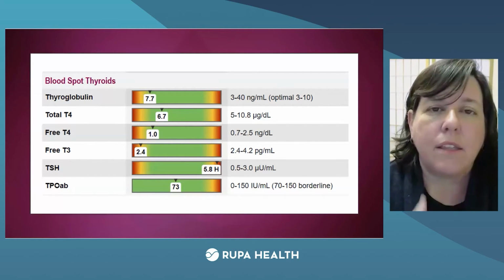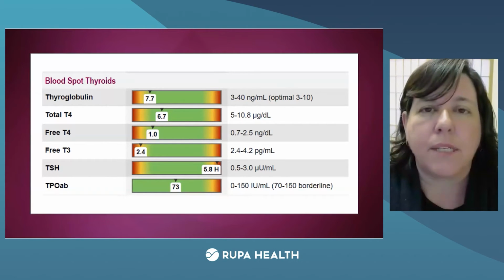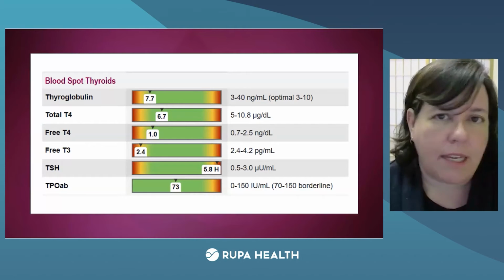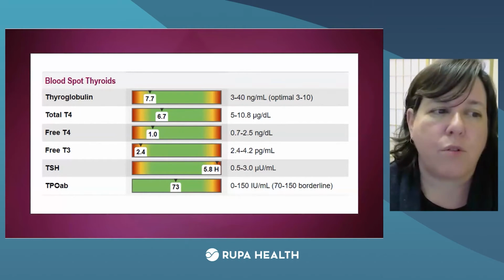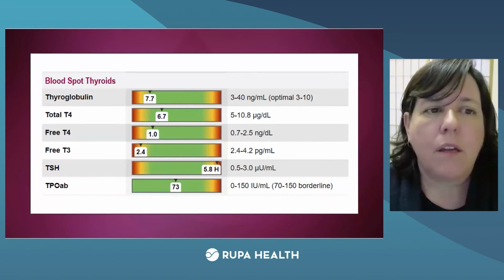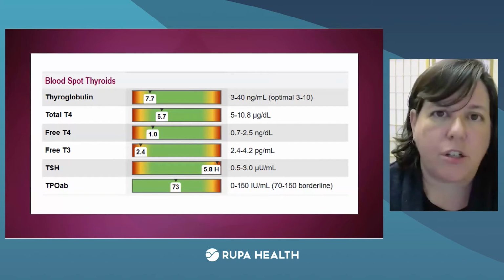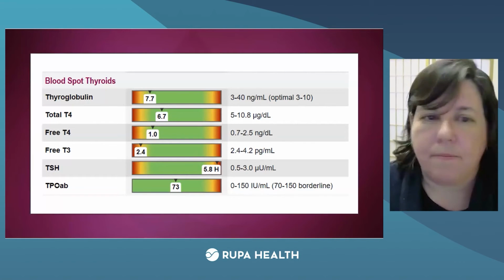And a lot of times this is a slow, gradual thing. So you can go back and look several years sometimes, and you can see this TSH that's been creeping up over time. But most people are going to diagnose them, especially if they've just done the TSH. But don't get confused. A normal T4, normal T3, and a high TSH is a problem for 99% of people. And if it's not, make sure you're really looking at things like cholesterol, blood sugar. It's not always just fatigue symptoms.